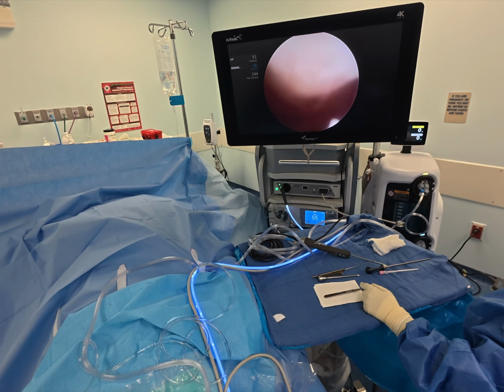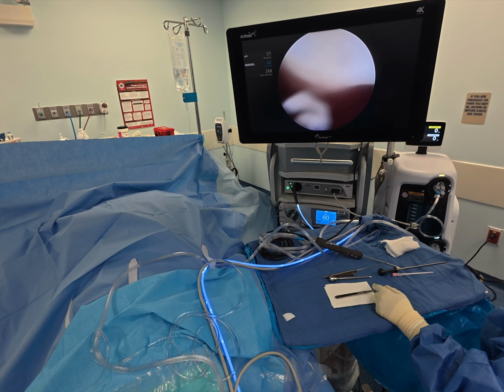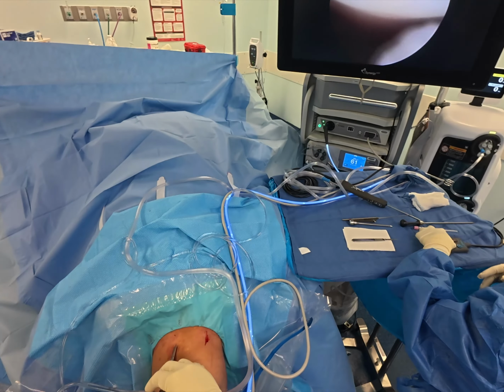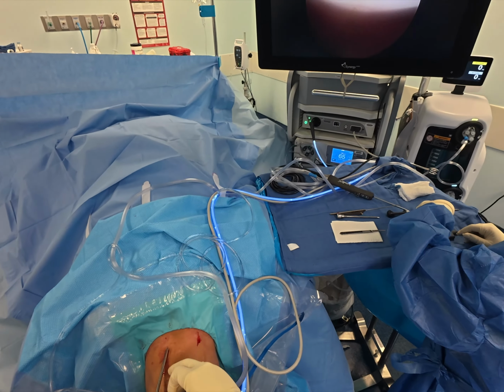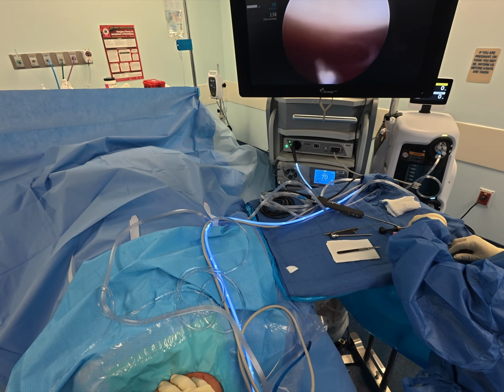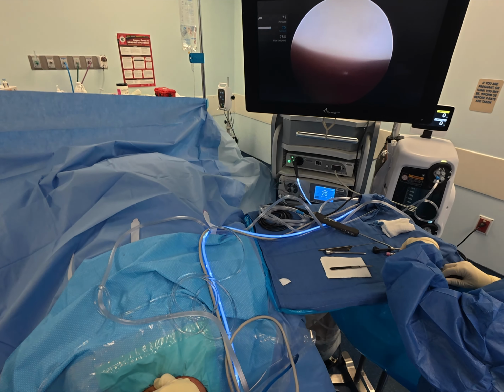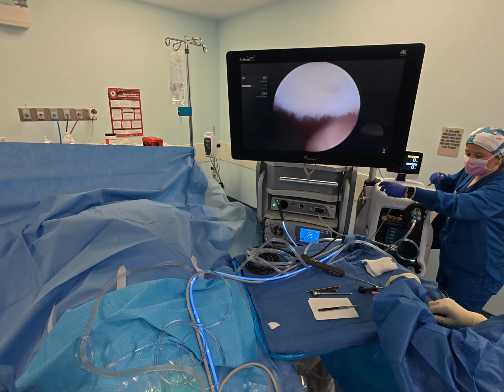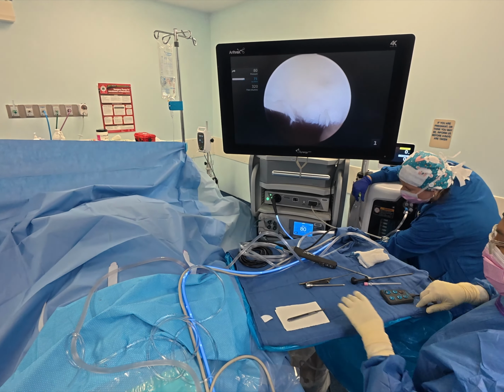We'll see it better. We saw in the MRI that the medial patellar articular facet go up higher was arthritic. Here's the lateral side. The cartilage looks nice and white. The medial side, that's the diseased cartilage. You can see that it's not healthy.